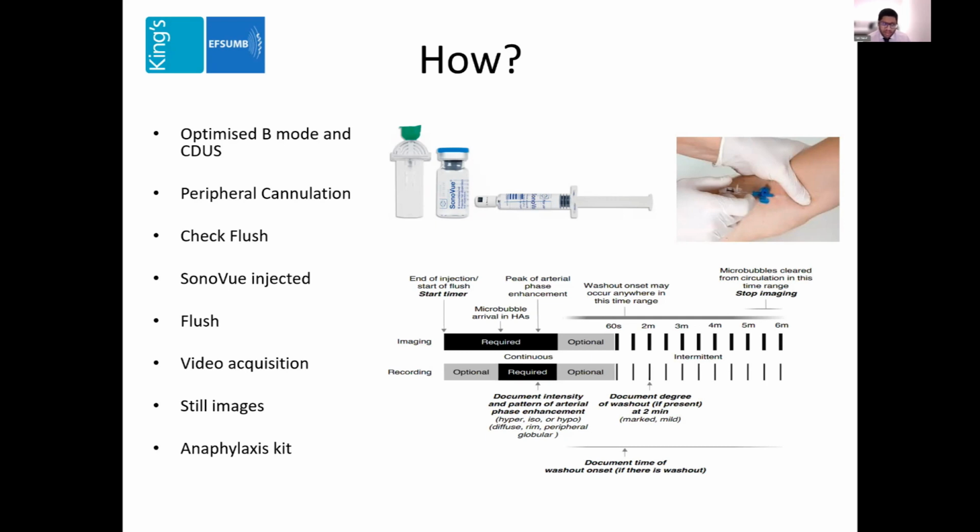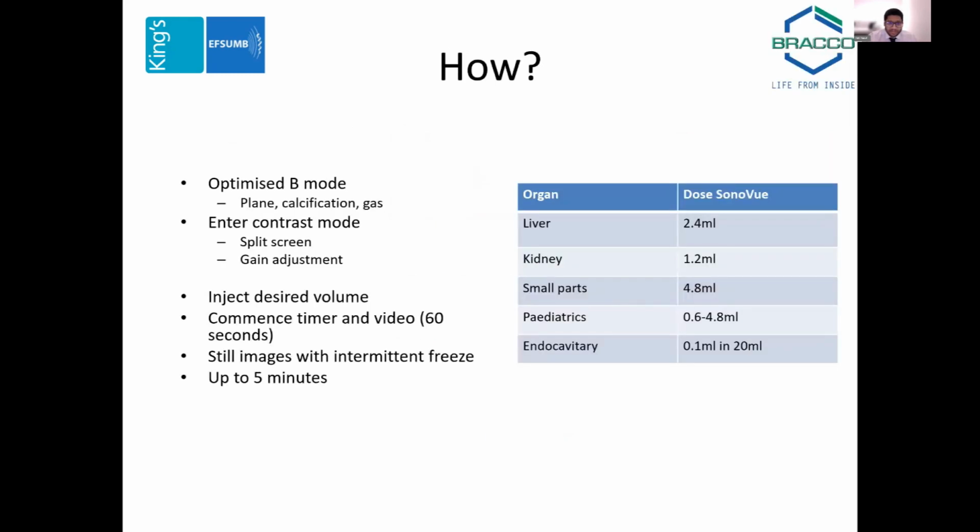You don't need to just try and interpret it there and then. You certainly wouldn't think about sitting in an MRI scan and interpreting the sequence as it comes through. So take your time, write a report that's of the quality that you want to give out rather than trying to rush one. And also, I must say that you need an anaphylaxis kit. So I would be practicing this in a place where you have an appropriate facility for anaphylaxis, because there is, no matter how small the risk, a risk present.